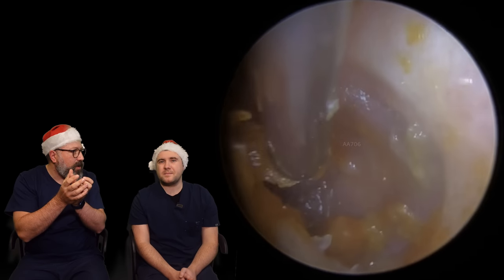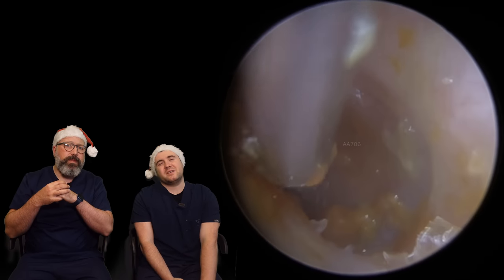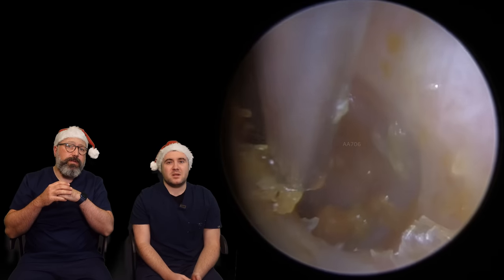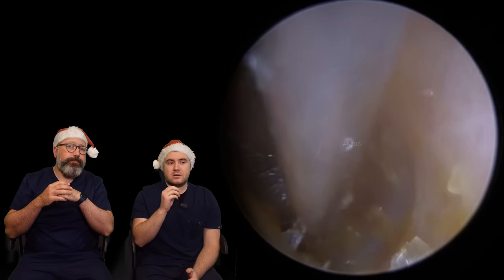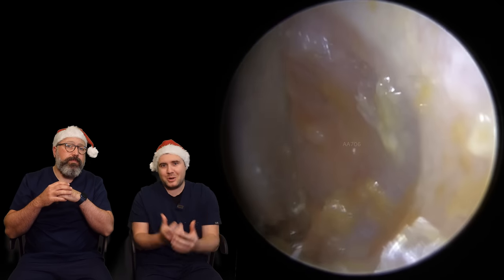Using olive oil keeps everything a lot easier for us to take away — it stays together in bigger clumps. Because this is literally like trying to suction soup up a straw, it's not the nicest thing to do. We know it's very difficult because you're not going to know what your own wax looks like. We usually suggest only a small amount of oil, not continued use for weeks and weeks, because that will have a similar effect to those stronger drops.